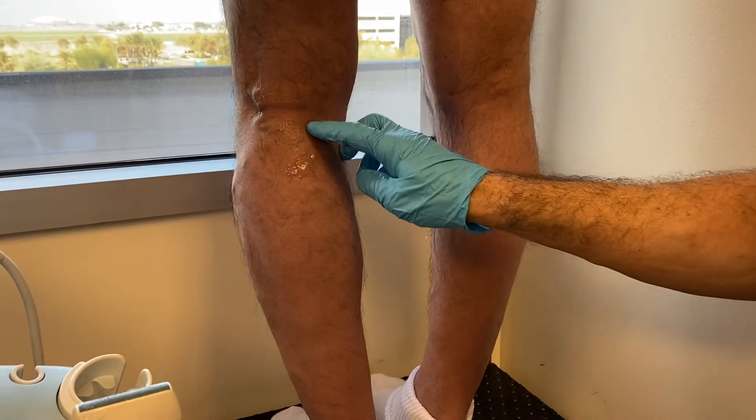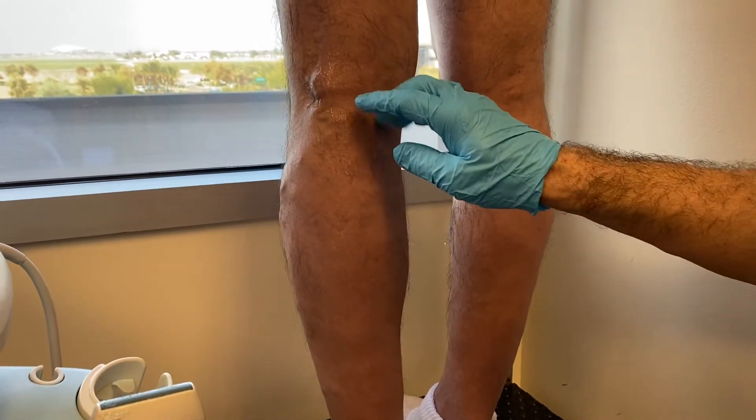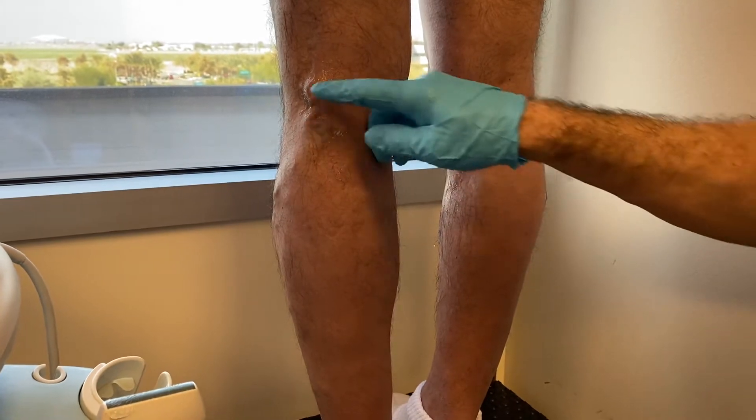I'm going to show you something today — it's called a popliteal fossa perforator. You'll see this type of vein on the back of the popliteal crease here.